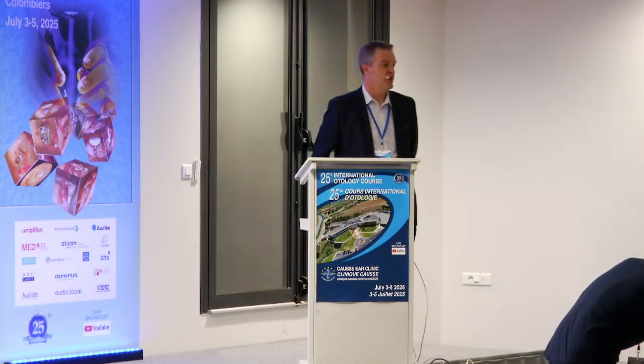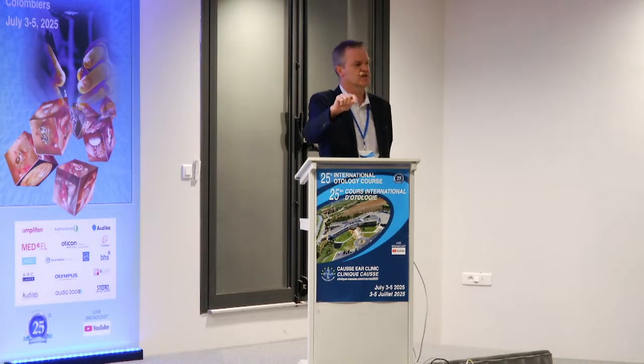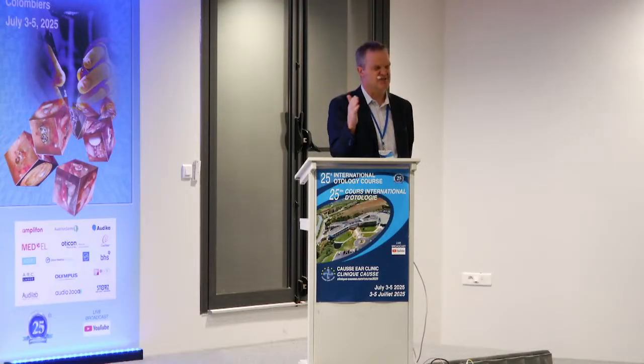It's actually a very good question. Chris was saying that he prefers to laser it. On this specific cement that we use, if you just dry it a little bit, you've got 20 seconds where, if there's no water or fluid attached, it doesn't affect the drying properties. So we don't laser on the ossicle itself, or scrape, but I do scrape the mucosa a little bit back. You'll see that normally the mucosa is already a little dried out and eroded, but we will move the mucosa a little bit back, not necessarily laser it.